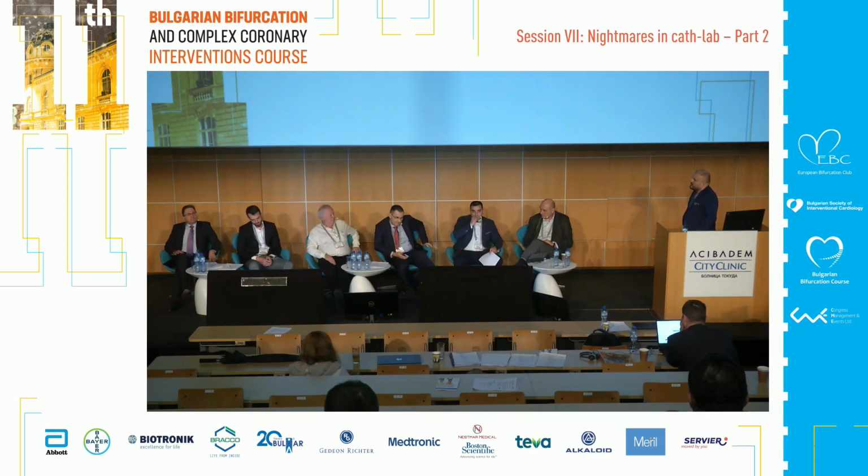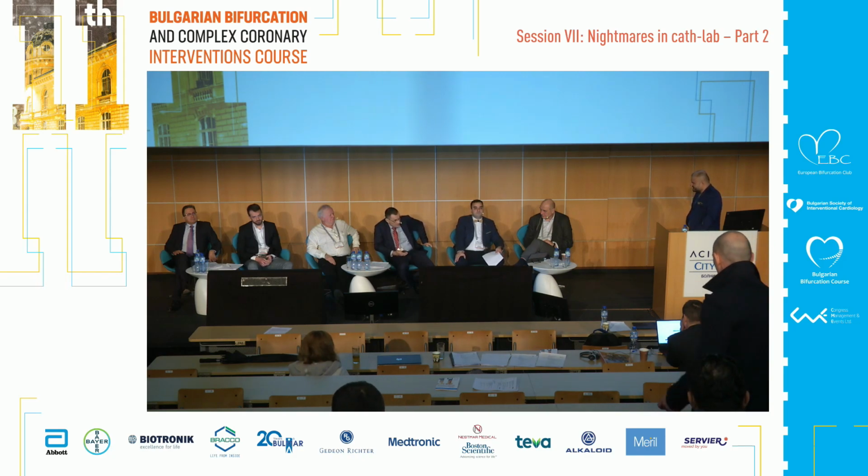I had some, let's say, good experience with such situations. Usually what happens is exactly the same. The snare catches the proximal part of the stent and cuts this part of the stent. It just elongates the stent struts at the given moment. It is just a cut from the snare. The snare is very, very strong. And in most cases you actually remove part of the stent. So most of the time it will be a partial extraction.